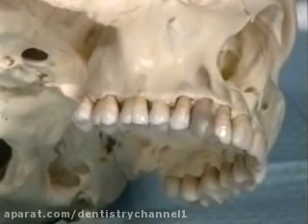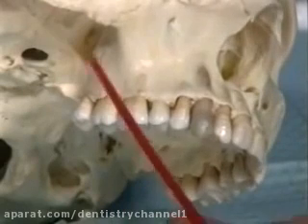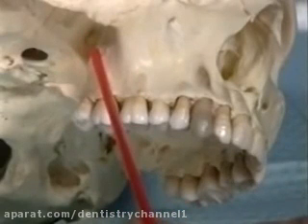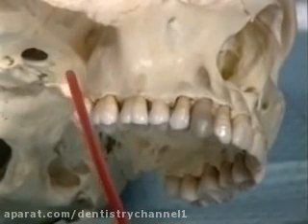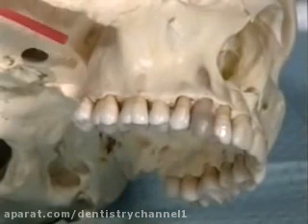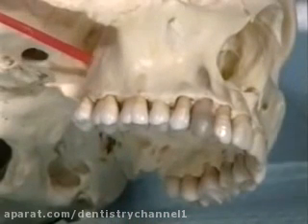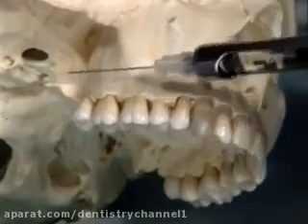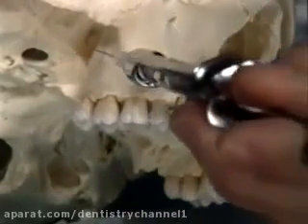The target site for the posterior superior alveolar nerve block lies on the posterior aspect of the maxilla, about 1 centimeter above and medial to the apices of the third molar. The nerve enters the maxilla here through one or more foramina. Because this area is convex, the needle must be oriented backward, upward, and inward.